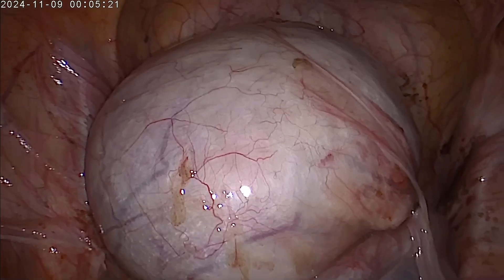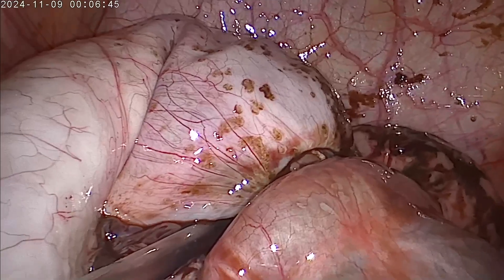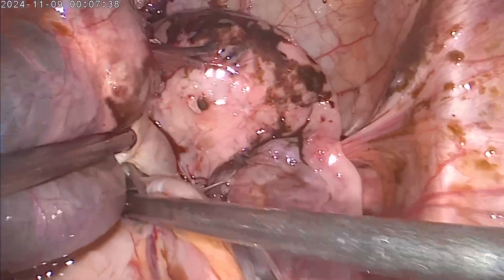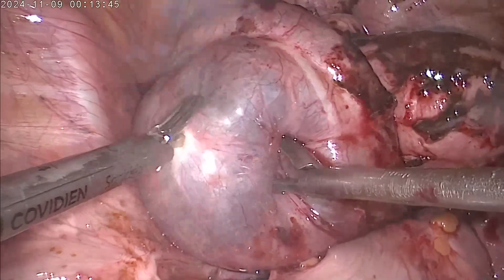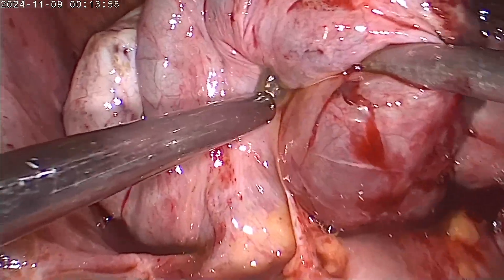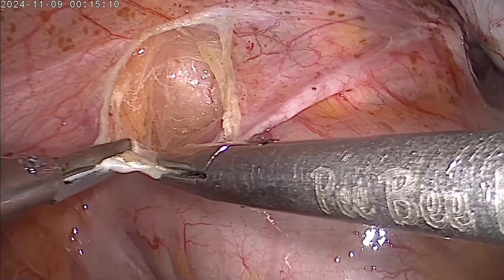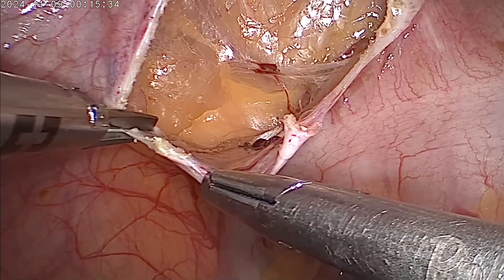We see a large endometrioma with the hydrosalpinx, which is drained completely. Next, we open up the pararectal space and perform the sigmoid mobilization.